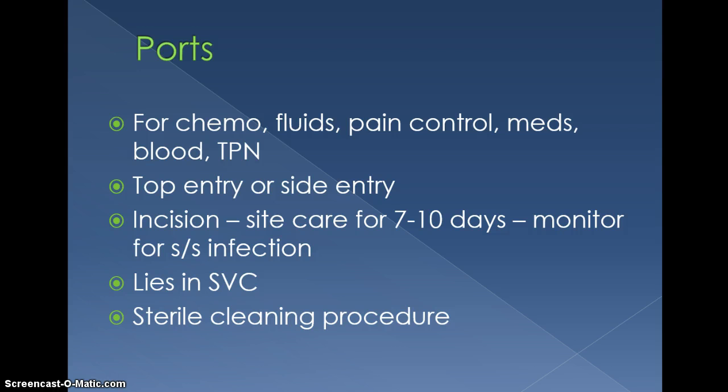And then with documentation, how the patient tolerated it, the condition of the catheter, including the length. Those things are measured before they're put in, so they have to be measured when they're taken out to make sure that you have the entire catheter. The time of discontinuation, any cultures that were ordered and sent, and then dressing applied, and anything else that is pertinent to the removal of it.